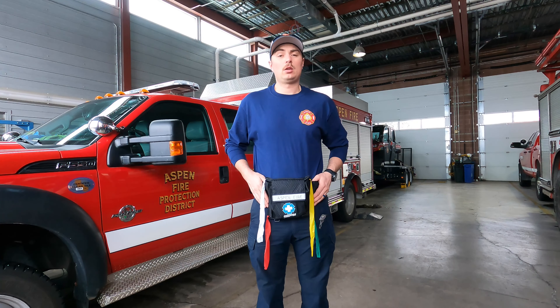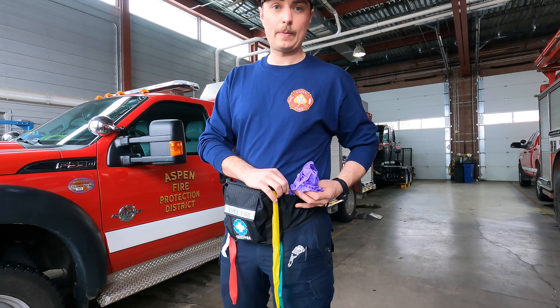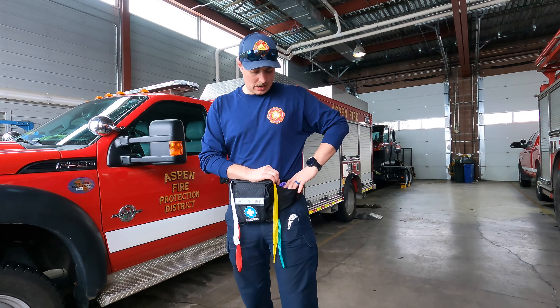On the side of the straps there is one pouch filled with gloves and one empty pouch that we will use during triage.